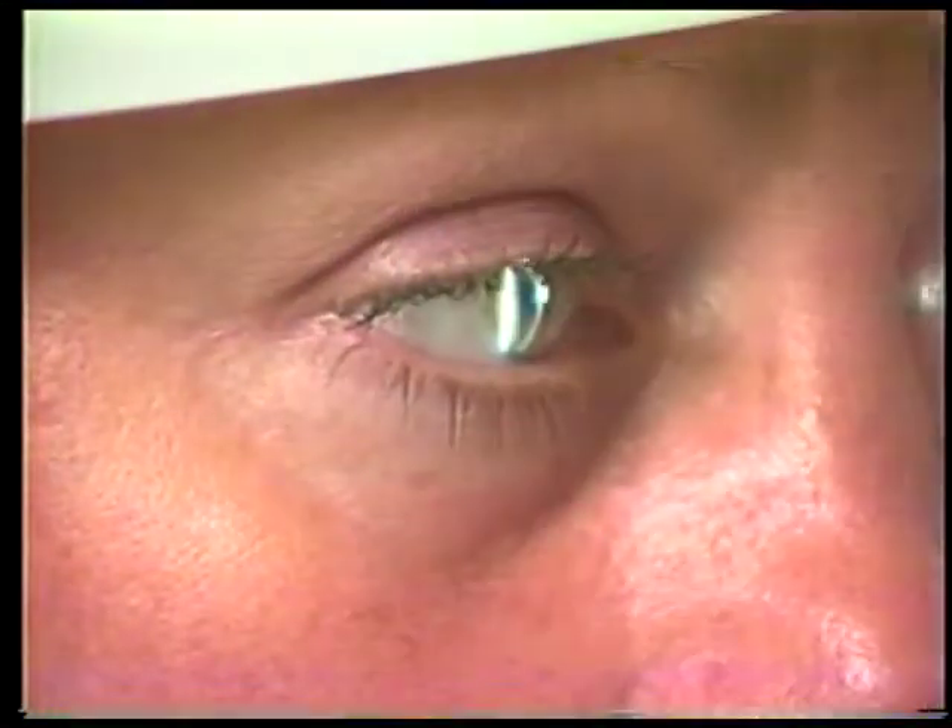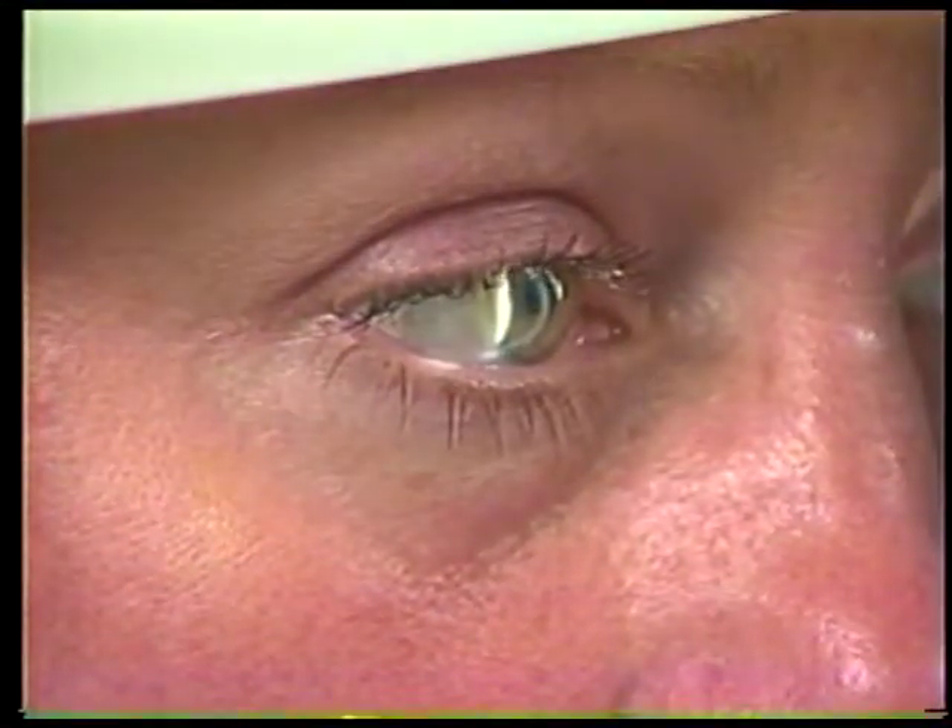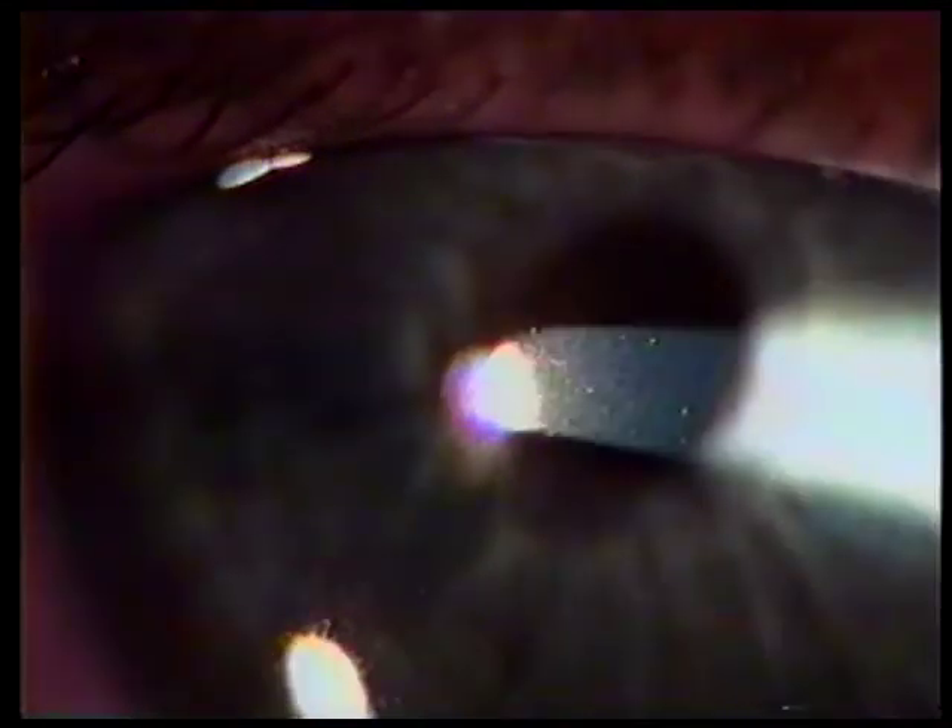Varying the angle and width of the slit beam are necessary to obtain the most from your examination. For example, the depth of a corneal lesion is best judged by using a fine hairline slit beam and a 35 to 45 degree angle between the illuminating beam and microscope. A broad light beam is more suited for determining the size and overall shape of surface abnormalities such as this iris nevus. A small bright spot beam of light angled in front of the dark pupil will reveal cells and flare in the aqueous in cases of anterior uveitis.